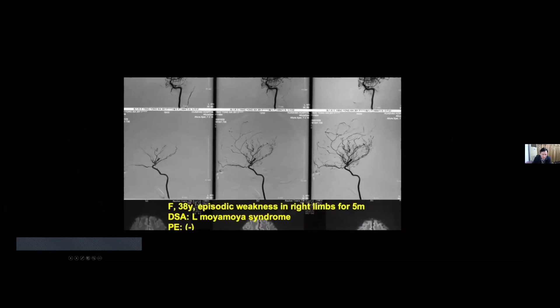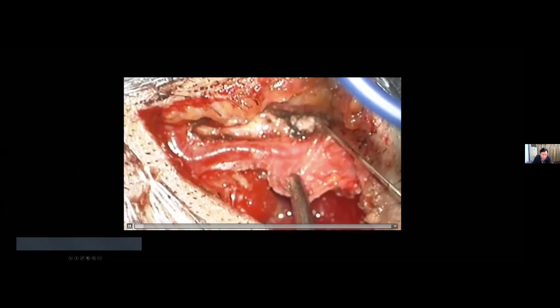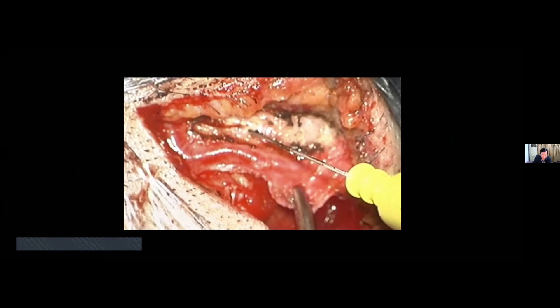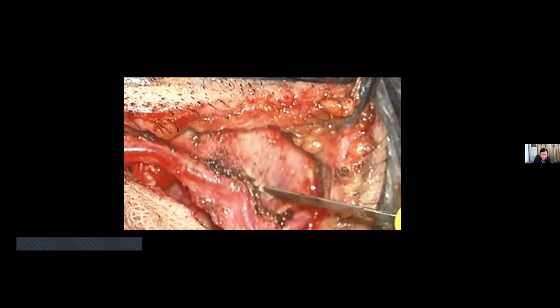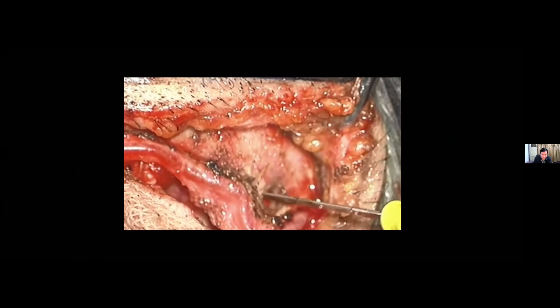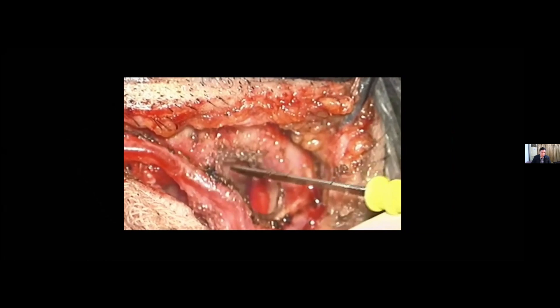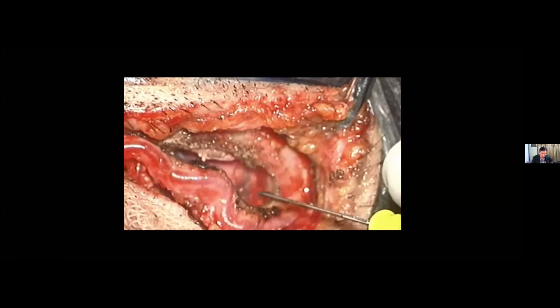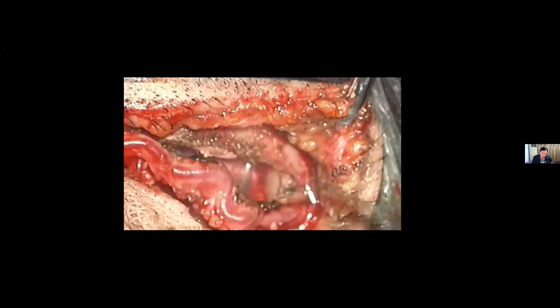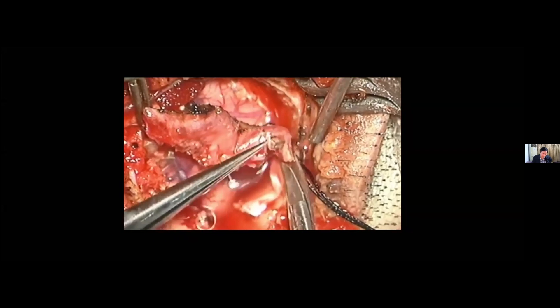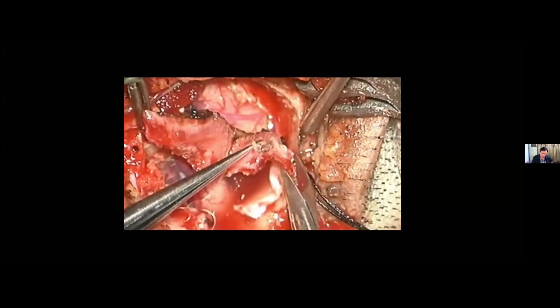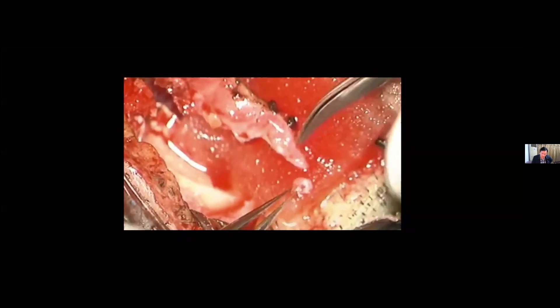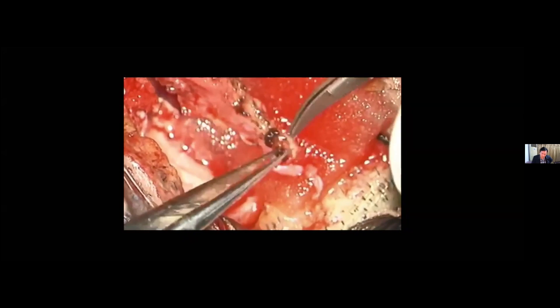This is the video of the operation. The skin incision is four centimeters. I used a cut-down technique to harvest the STA, using monopolar to dissect — it's very fast and safe. The small bone flap is around two centimeters. After ligating the distal end of the STA, we cut it and trim one end of the STA.